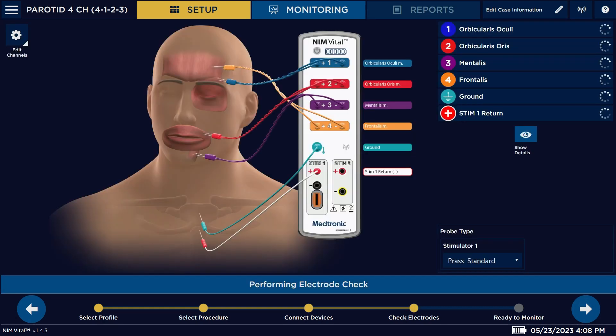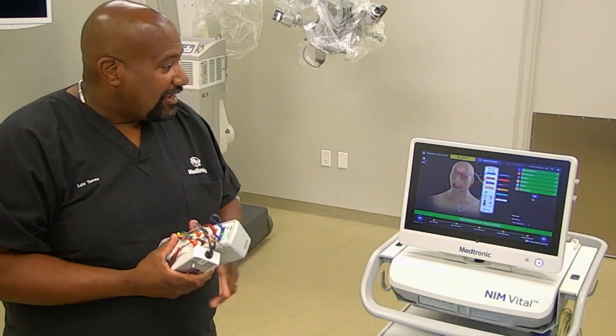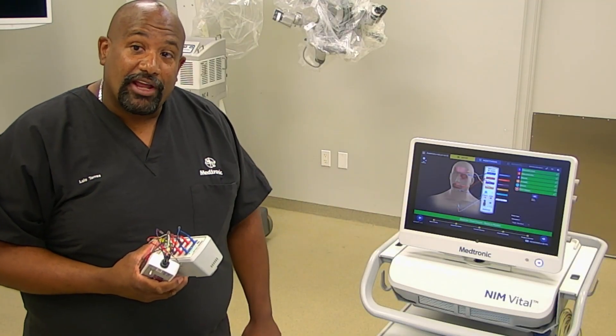Here's your next part where you're going to connect all your electrodes. You're going to bring your patient interface close to the head of the bed where your patient is located. For parotid, we're going to be using our subdermal needle electrodes. We're going to have electrodes in the forehead, above the eye, above the lip, and at the mentalis or at the chin. We're also going to have electrodes in the sternum, which is our green ground electrode, and our return lead. All of that is depicted here on the screen.